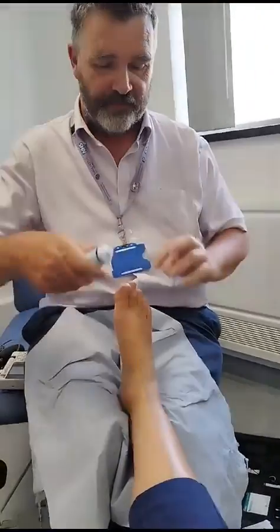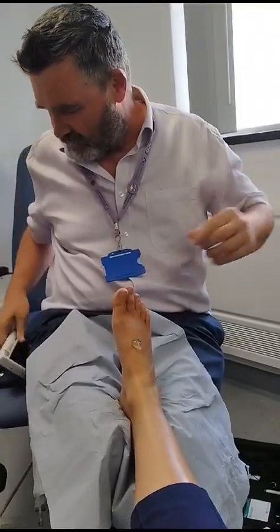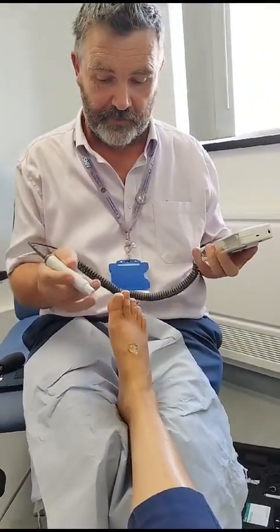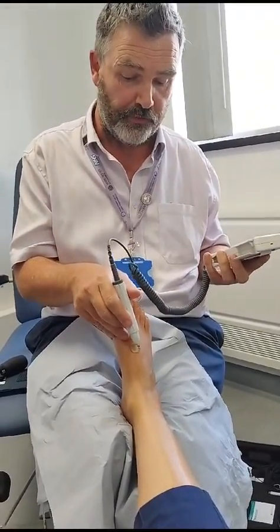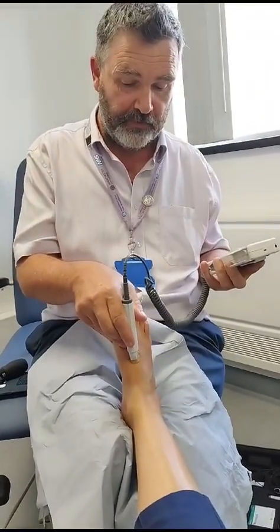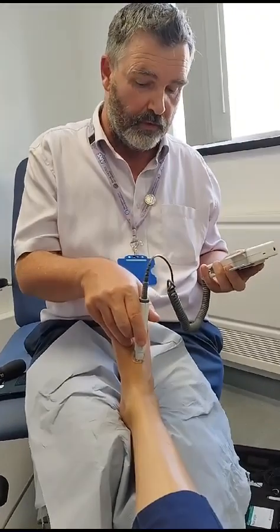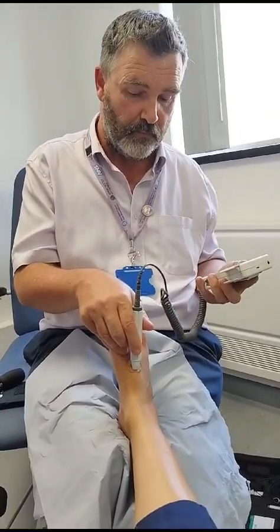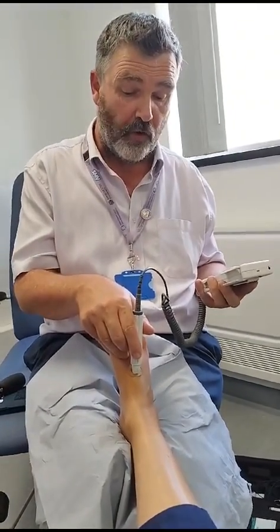Second P: Phases. I'm going to put some jelly on top of the foot. I'll get my Doppler and turn it on. I'll angle at the ankle — as we talked about before when holding the Doppler — then sweep across the middle of the foot to listen for that artery, going right across and considering whether that sound is monophasic or multiphasic.